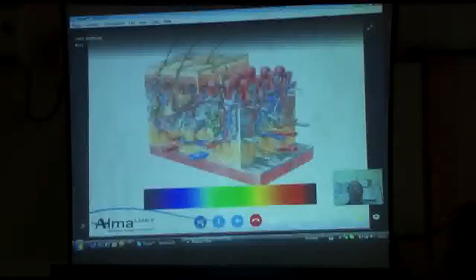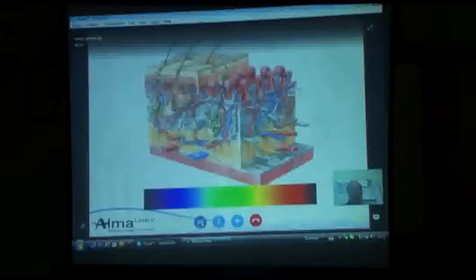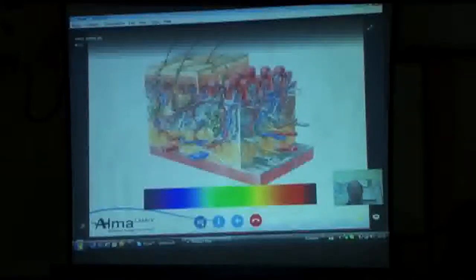And when you talk about the skin as the target for these lasers, one can see that the skin is a very diverse, very involved structure, and contains many structures that have different colors. And this is why we're able to aim or introduce laser beams in different colors to interact with some biological matter that has the ability to accept those photons or electromagnetic radiation in their properties and change their behavior.